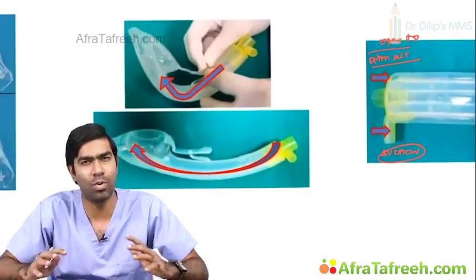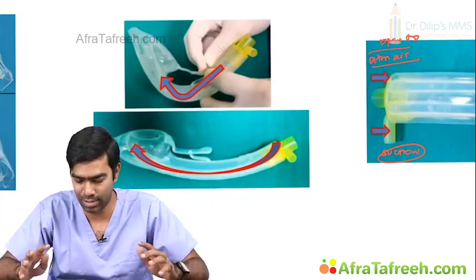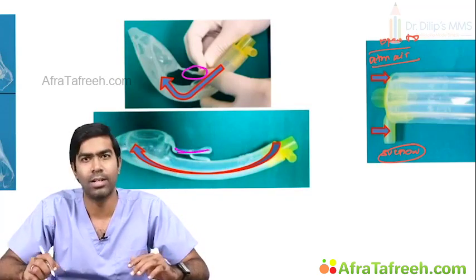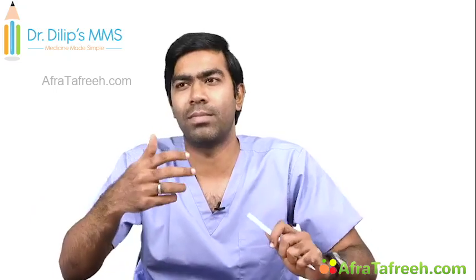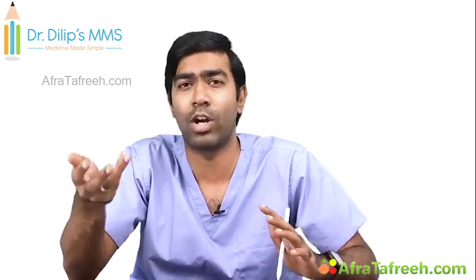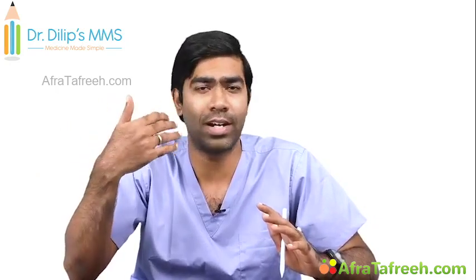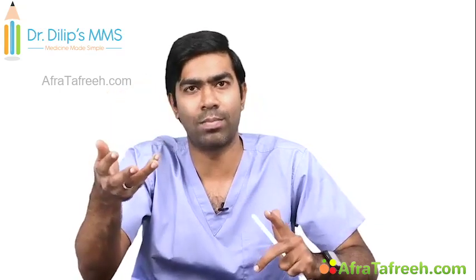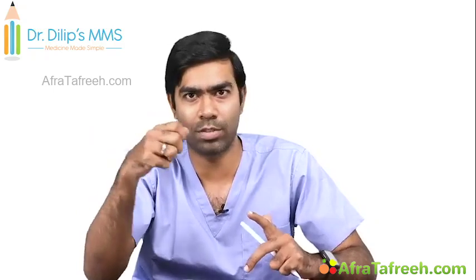And you can see one more beautiful thing that has been given with this Baska mask: the proximal tab. You can see this is the tab. Why is this tab given? Sometimes these LMAs are very difficult to insert because the oropharyngeal curvature is very curved in some patients, especially in emergencies when we are looking for these devices for a patient who cannot be intubated. We find it very difficult to insert this device because the curvature may be so curved. To avoid that problem, the Baska mask gives this proximal tab.